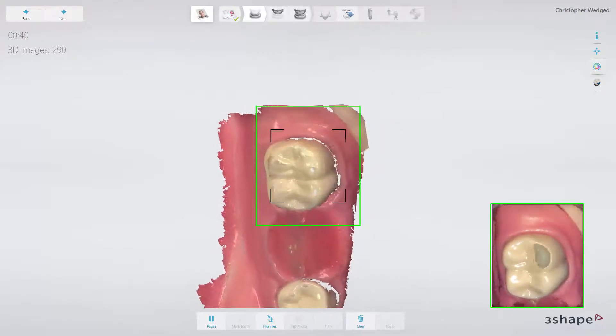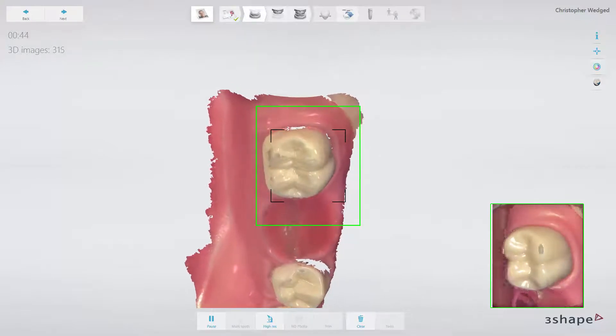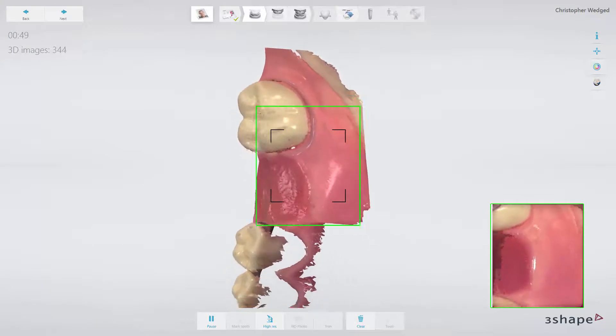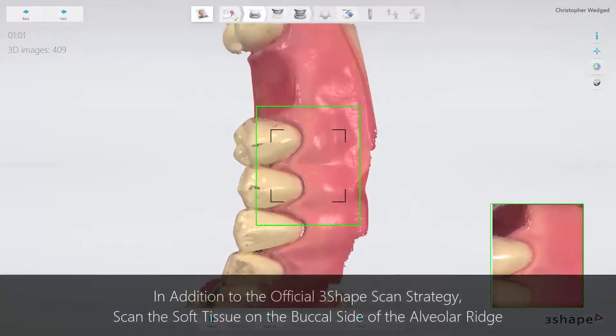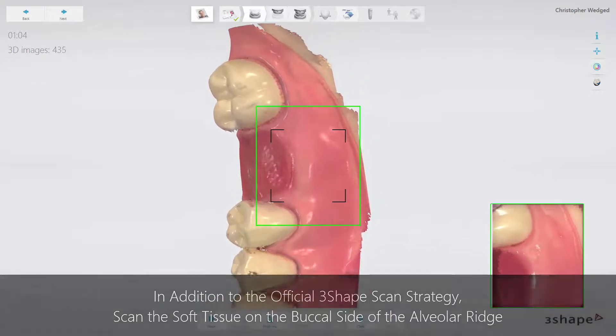Turn to the buccal side, covering the area behind the molar — the retromolar area — in case we need the support for the guide. Go buccal again, as deep as possible, with a 70 to 80 degree angle, to also cover the soft tissue.